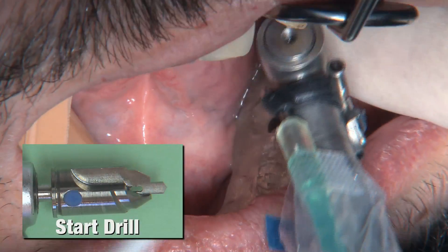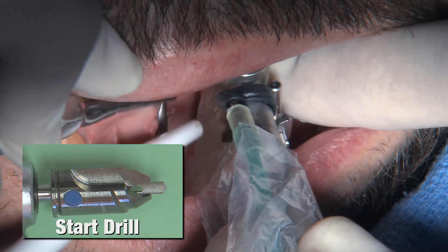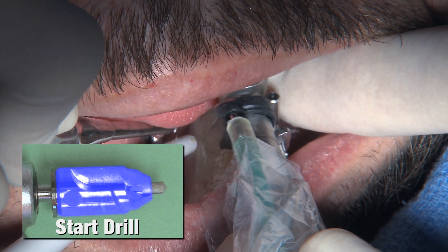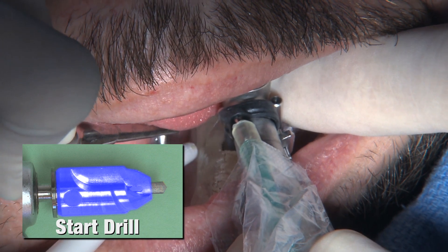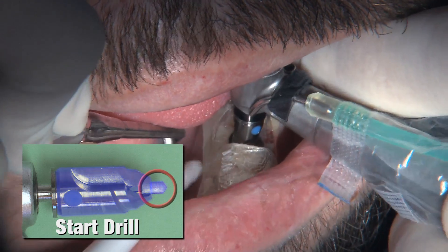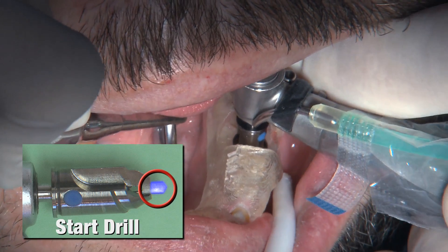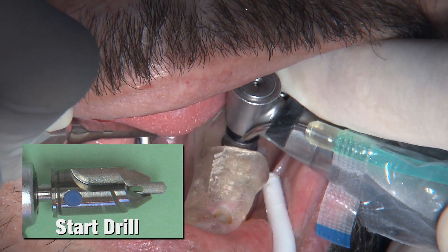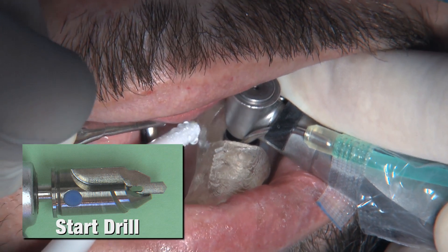We've got the surgical guide in place — I'm holding it down with my index finger. This is the start drill; the part that's blue is responsible for the tissue punch. We're not going to lay a flap. Dr. Bockhorst, during the digital treatment plan, knew I didn't want to lay a flap if I didn't have to, and he felt this case would be fine without it. The tissue punch tip countersinks into the bone, making room for the rest of the drills.